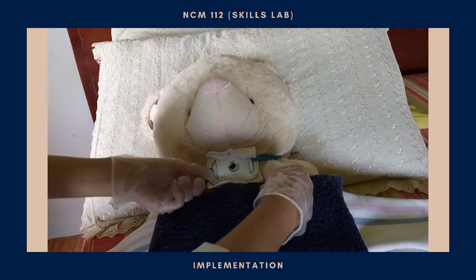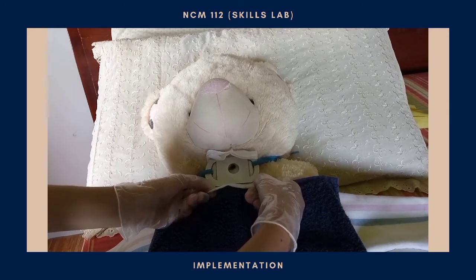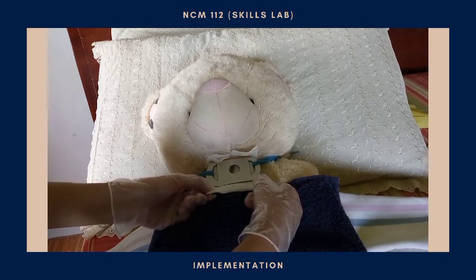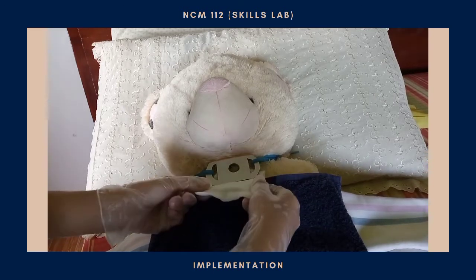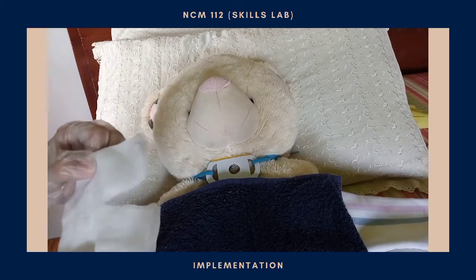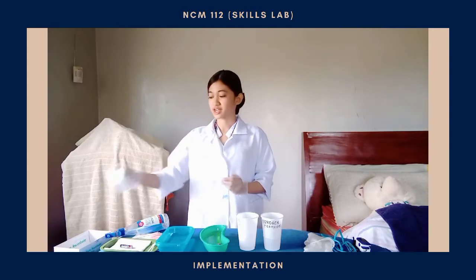Then, gently slide the tracheopad or dressing downward by holding both sides of the lower part. Then, simultaneously check for exudates, drainage, skin breakdown, irritation, pain, and inflammation. Check the dressing and also the site of the tracheostomy. Then we're going to discard this. Discard the used tracheal dressing.